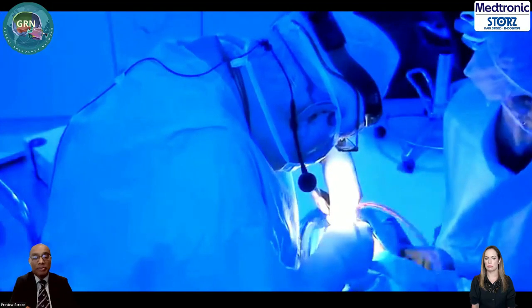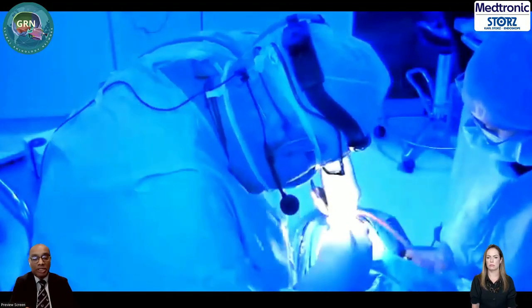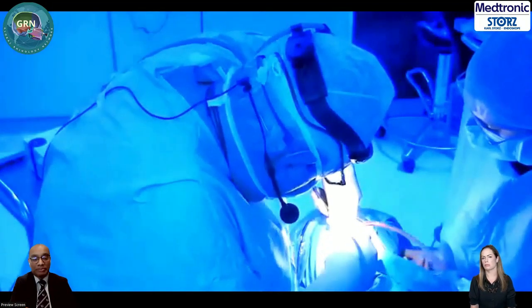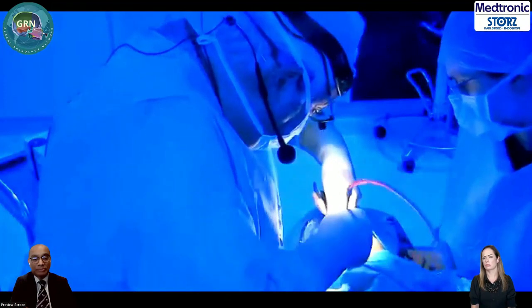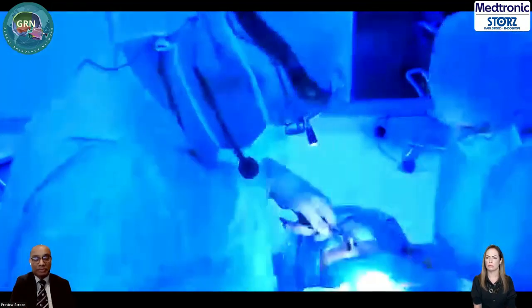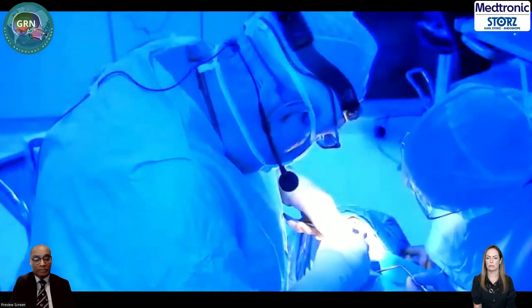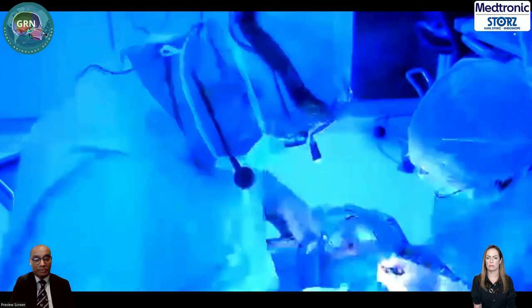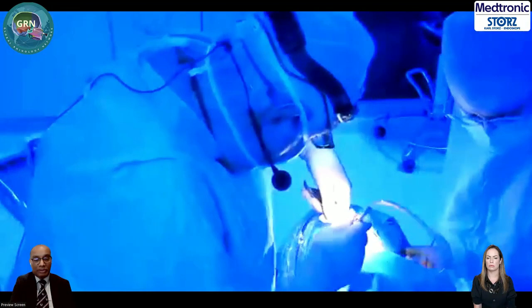Hello, very safe. Can we have an endoscopic view, please? Hello. Andrea.